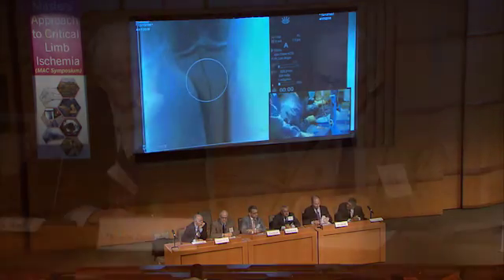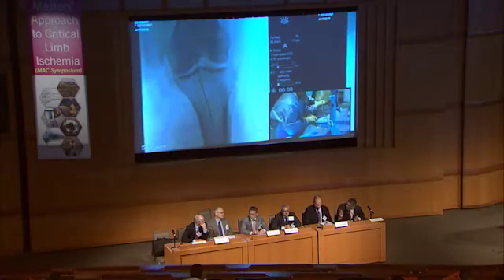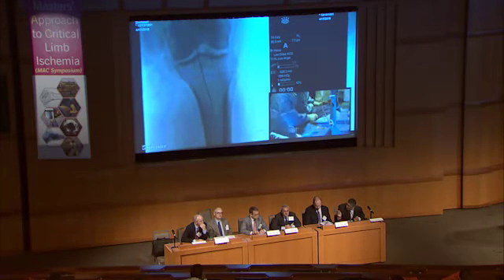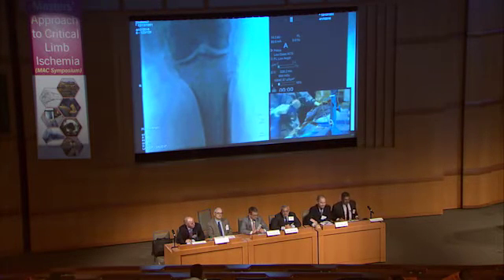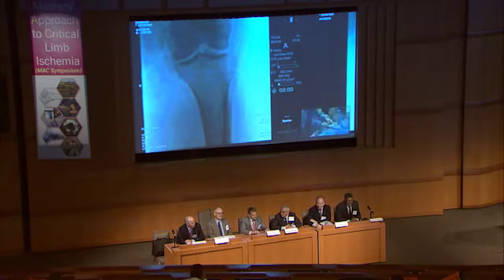That's what we would do in our institution here. So John, Thomas just suggested, I'm sure he didn't misspeak, to open the CTO of the posterior tibial and place a drug-eluting stent. So your thoughts? I'm just trying to spice this up a little bit. Well, I'm thinking about Mark Burkett as we talk about 2 or 3 Viabahns and some drug-eluting stents below knee.